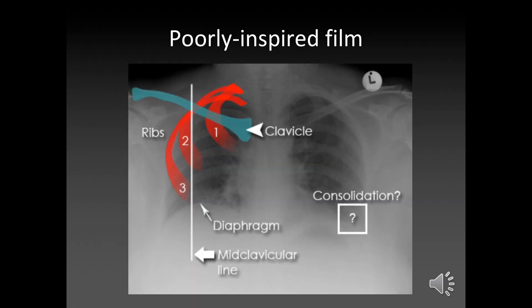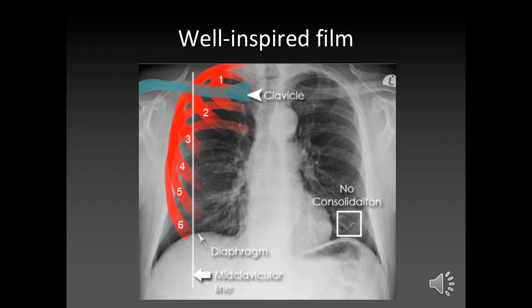This is a poorly inspired film — you can only see three ribs measured to the mid-clavicular line. You can't really see the heart; it all looks quite congested with white areas that would usually suggest fluid, as in heart failure. The heart looks quite big and there appears to be consolidation. However, when you do a proper PA film on the same patient, there is no consolidation, the heart is completely fine, and you get a good number of ribs visible.